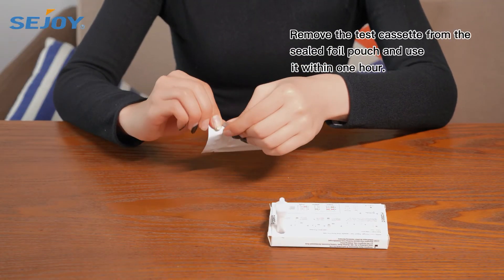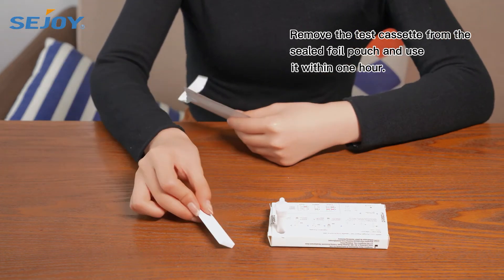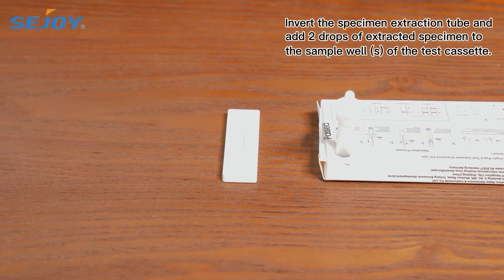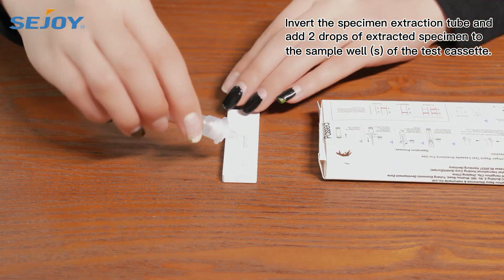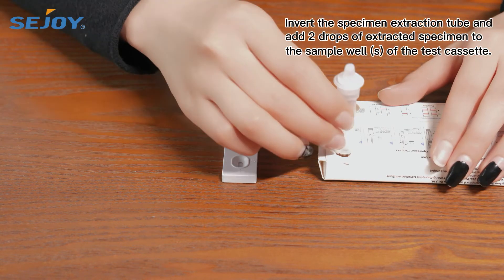Remove the test cassette from the sealed foil pouch and use it within 1 hour. Invert the specimen extraction tube and add 2 drops of extracted specimen to the sample well of the test cassette.